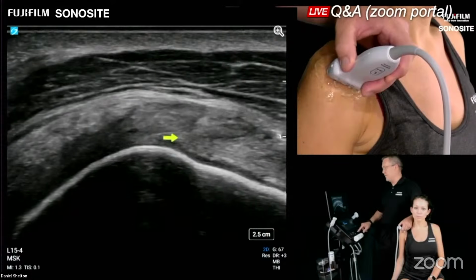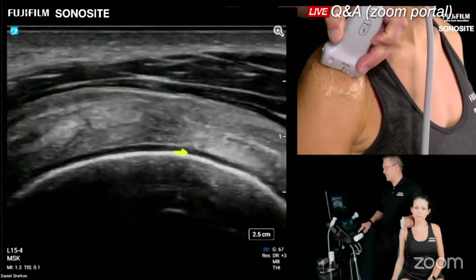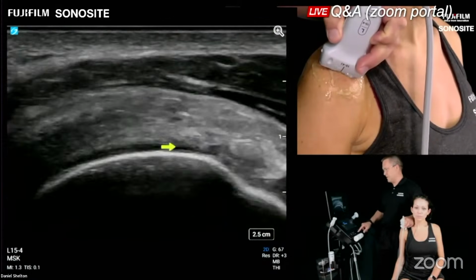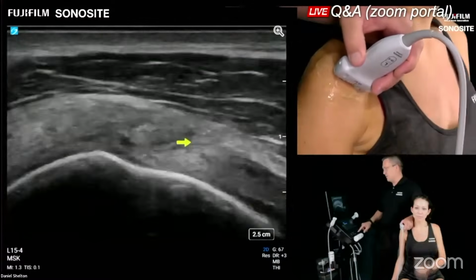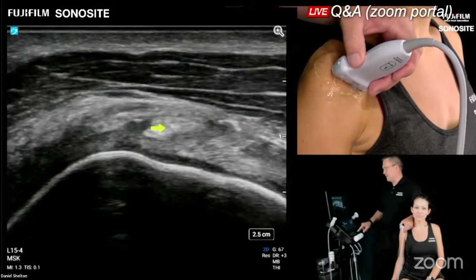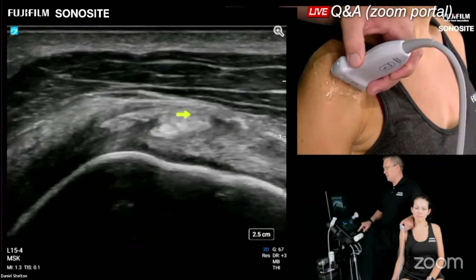A lot of the underneath fibers will even be traceable proximally to another structure that's a little bit more detailed, and we can cover that in the Q&A, but we won't cover it now, or I'll get way off topic. But back to the biceps and the coracohumeral ligament.